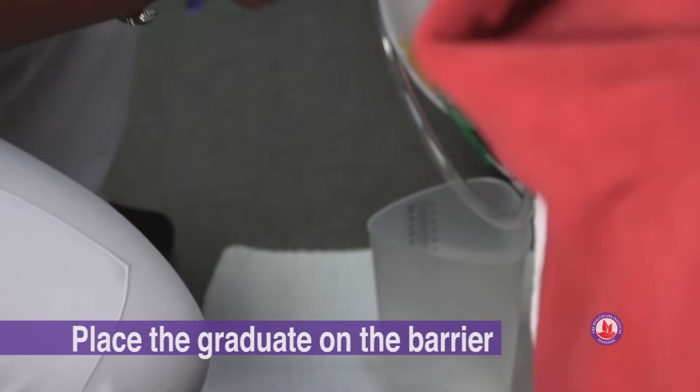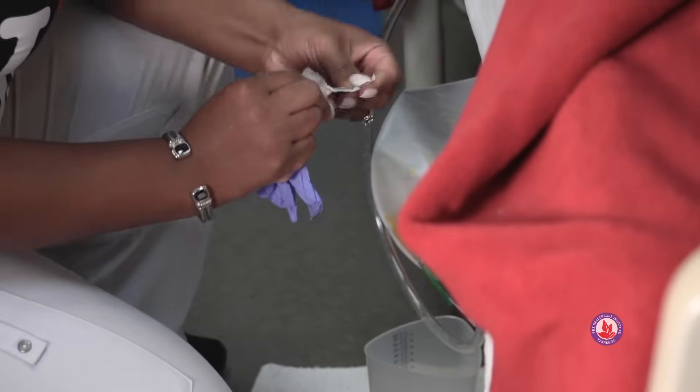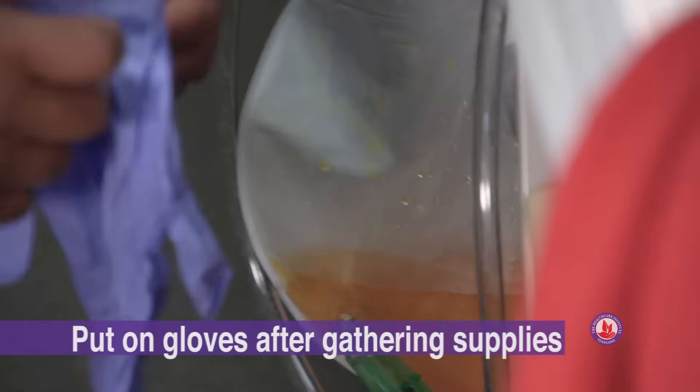We have our graduated cylinder and I'll go ahead and halfway open this alcohol wipe and sit that on my barrier. Now that I'm ready to start, I can put my gloves on.